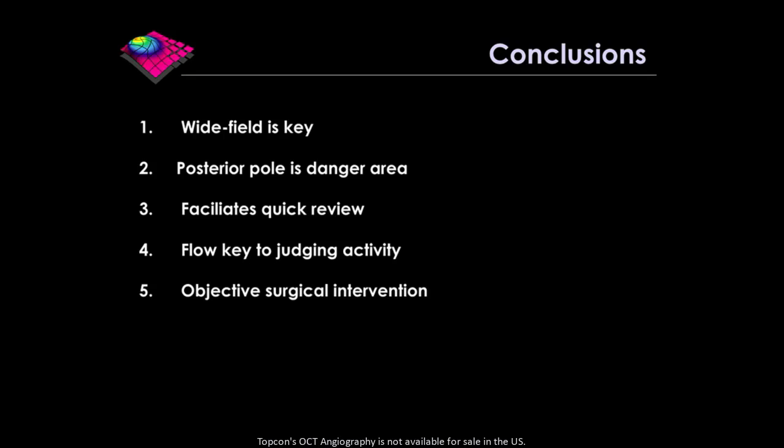I think it may help with objective surgical intervention. And this is again born from my frustrations about when is the appropriate time to surgically intervene. And we certainly have some patients with tractional retinal detachments that are not involving the macula, that have been stable for a long time. And actually, you would probably do the patient more harm than good by jumping in. But this is a first way for us to try and objectively quantify those things.